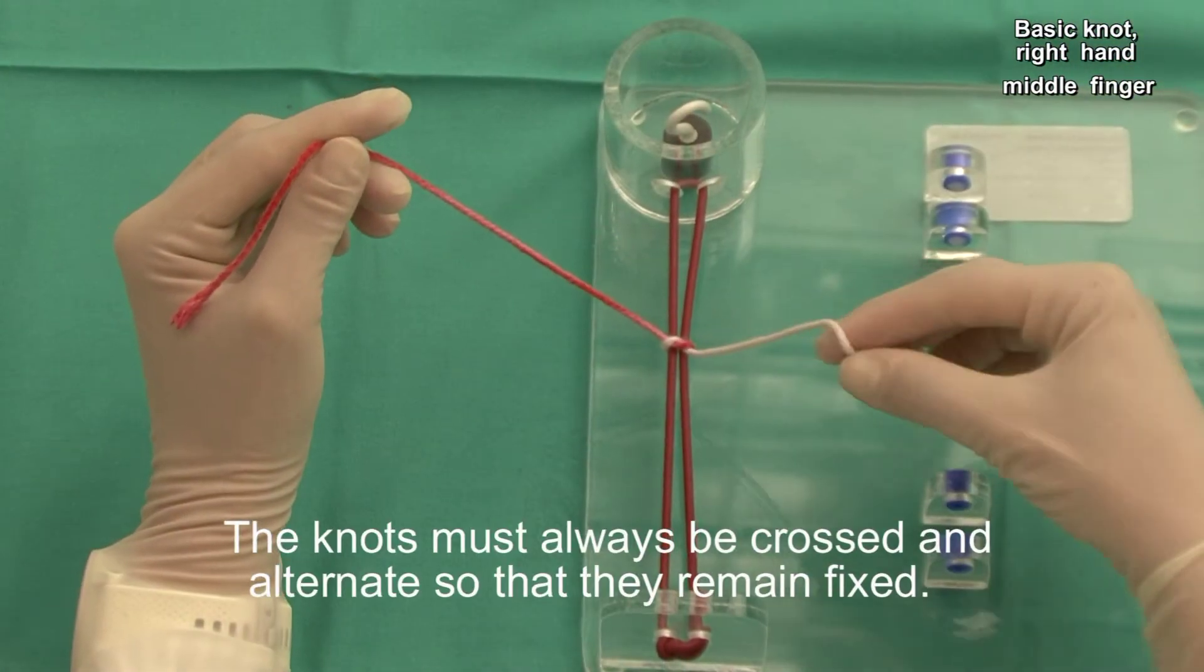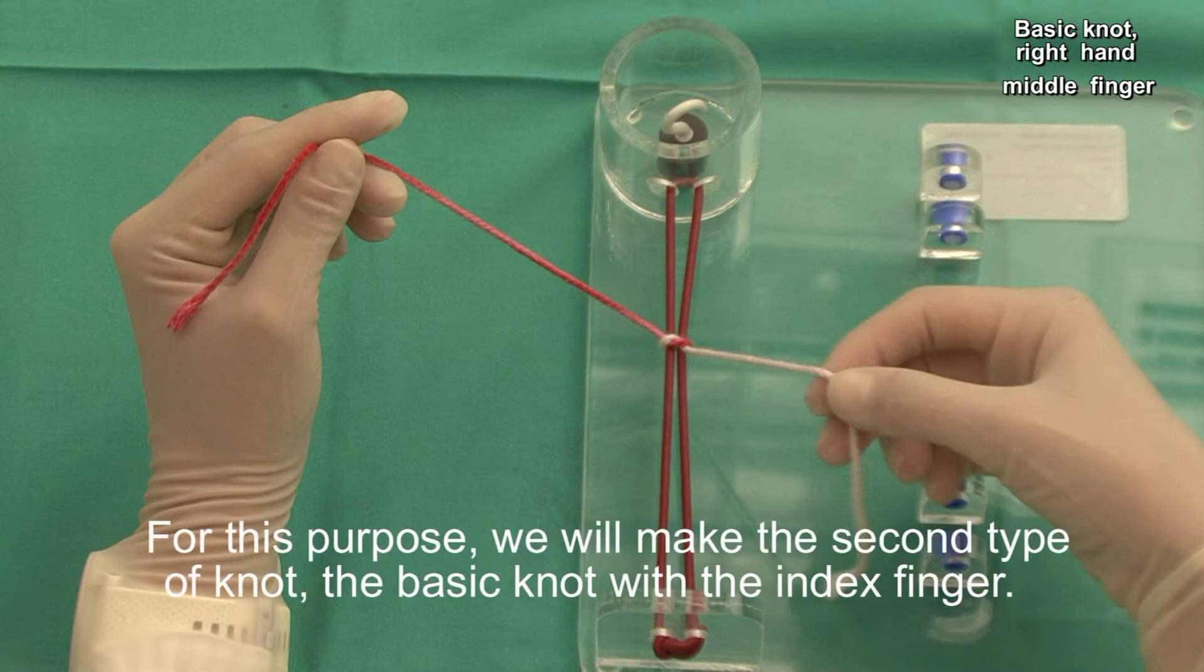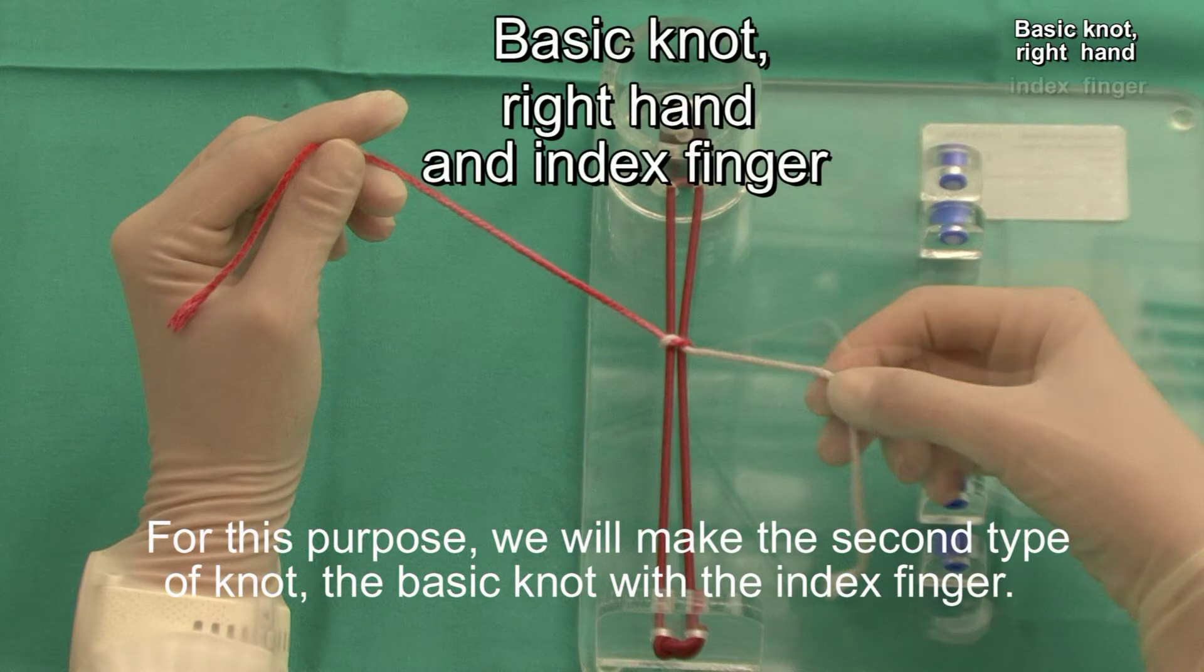The knot must always be crossed and alternated so that they remain fixed. For this purpose, we will make the second type of knot, the basic knot with the index finger.